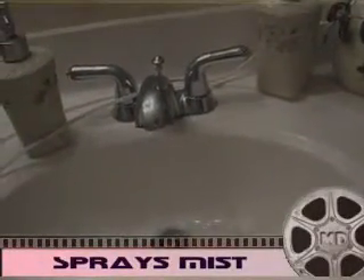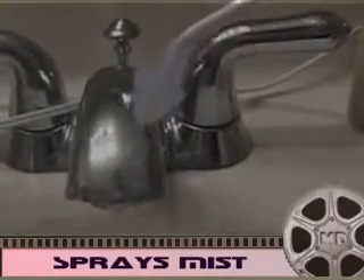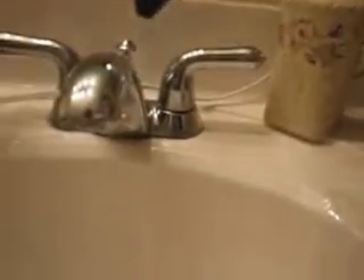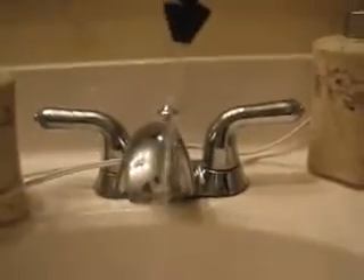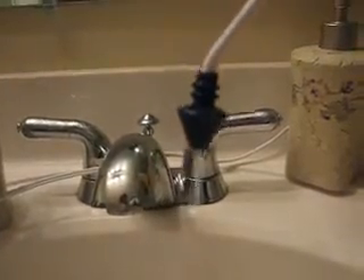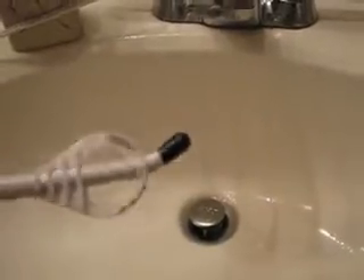There's a special misting tip — I'm going to zoom in and show you that. You can also put the older original tip on the unit, but you've got to use caution because that would be a little too intense to pulse into your sinus cavities. They also include a tongue cleanser attachment as well.